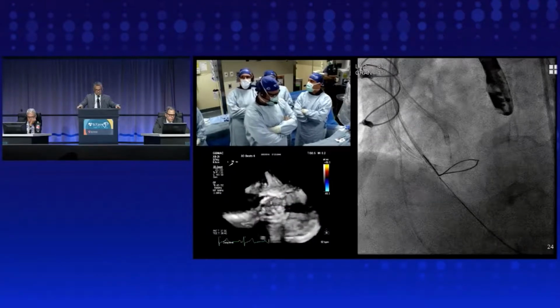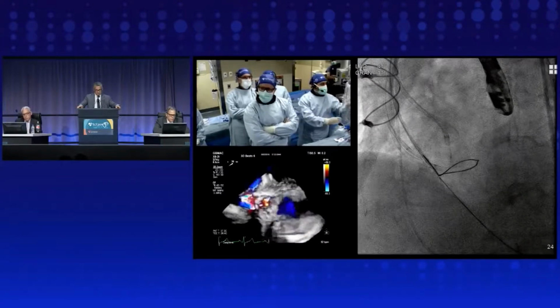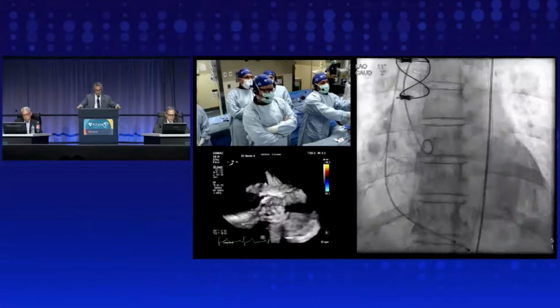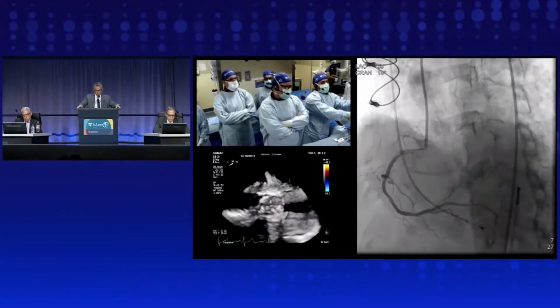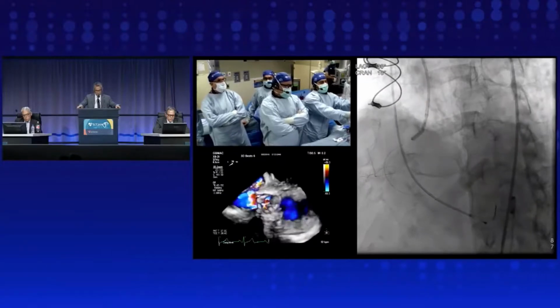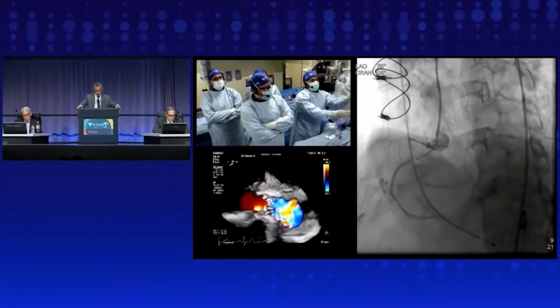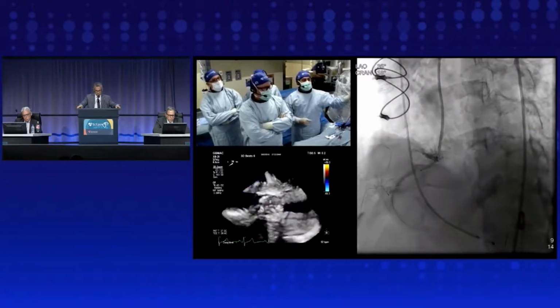It wasn't really clearly identified on the pre-angiograms, but we identified a severe lesion at the ostium of the right coronary artery. So, Jamie, maybe you walk us through how you managed that and made sure that that stent didn't get in the way of what we were doing. Sure thing. Thanks, Mark. Pretty straightforward ostial right coronary lesion.